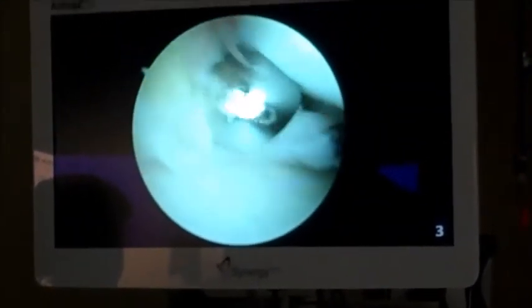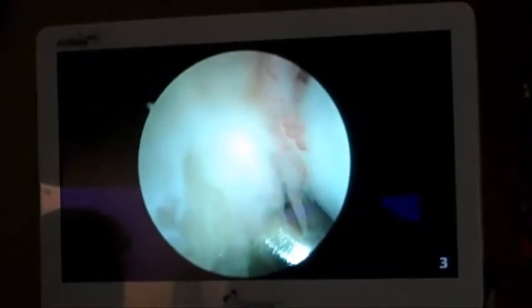You can see around it — this is all scar tissue that's developed in the joint from the previous injury. You can also see at the top of the screen here, this is what we call synovitis, which is inflammation of the joint tissue. We'll also be removing that.